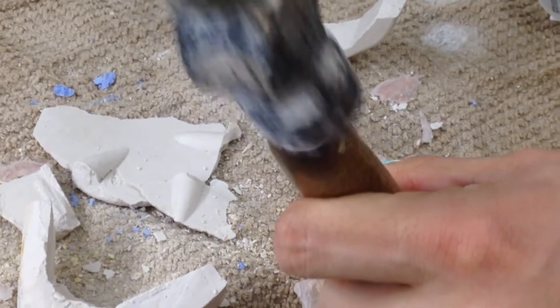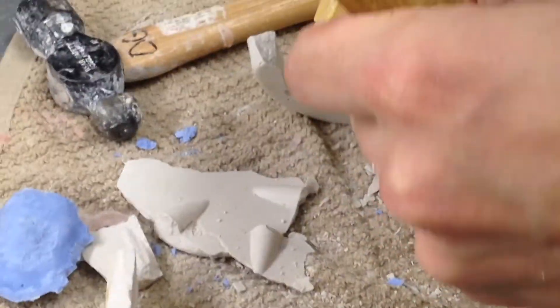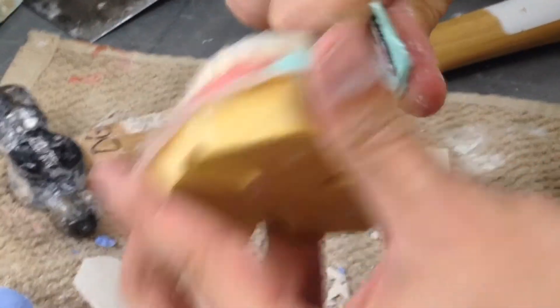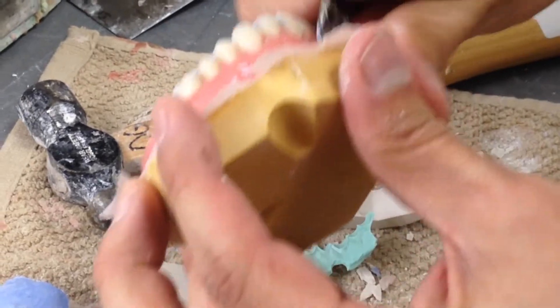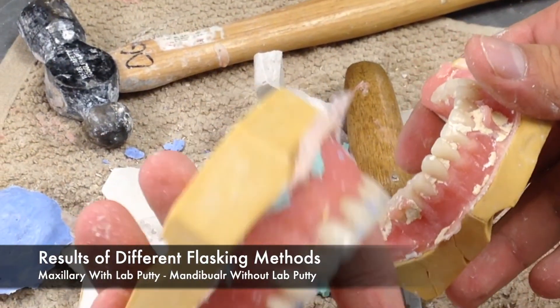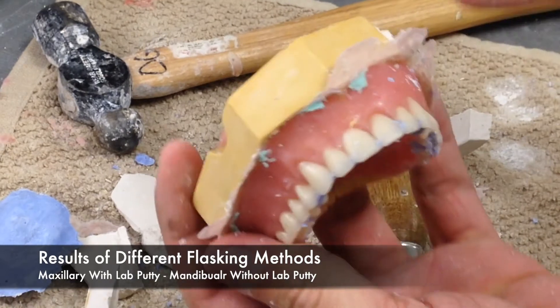Upon completion of the deflasking, you are able to assess your flasking techniques, your boilout procedures, and your packing and processing. You can do this by evaluating the acrylic. If you see porosity or areas that were under-packed, you can then reassess your techniques. Here we have one technique using a laboratory putty and the other without.